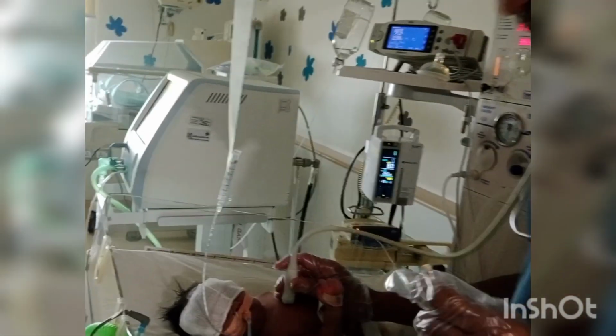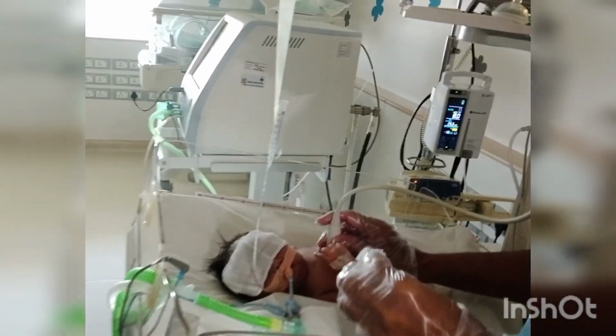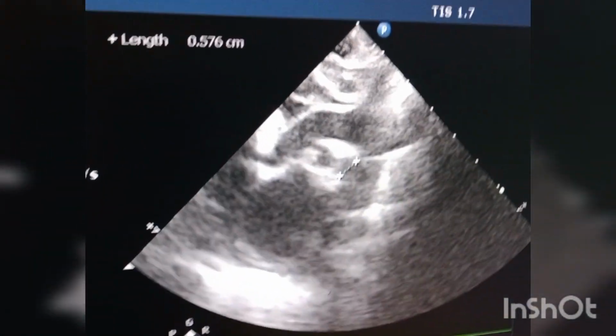So you can see the aortic arch view. This is the arch view, where I kept my probe in the suprasternal space to get this view.